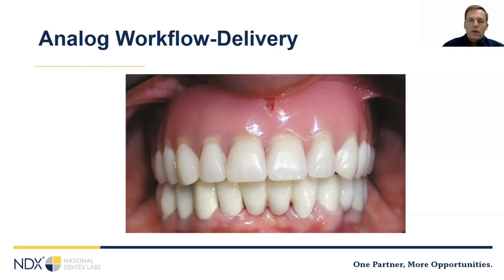And so one of the challenges, one of the clinicians told me this once, and I thought it was kind of a good thing. In some ways, each time you see the patient in the analog denture workflow, it's like starting over. You're not necessarily guaranteed that you're going to get continuity from each step onto the next just because of the nature of the case. I mean, oftentimes you do, but there's changes that can occur.